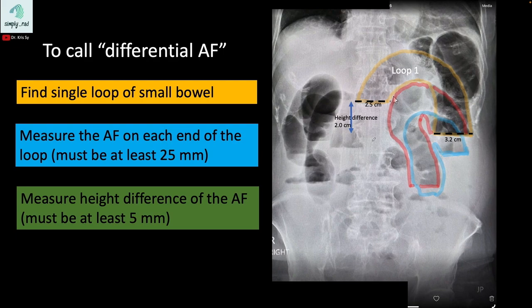To call differential air fluid levels, we first identify a single loop — let us consider loop number 1. Next, we measure the air fluid on each end, obtaining 2.5 cm and 3.2 cm. The height difference is 2 cm. We have fulfilled criteria 1, 2, and 3. Therefore, we can now say that differential air fluid levels are present in this radiograph.